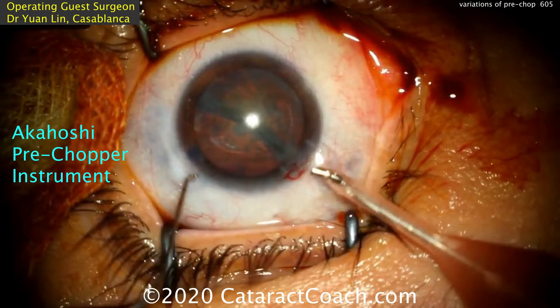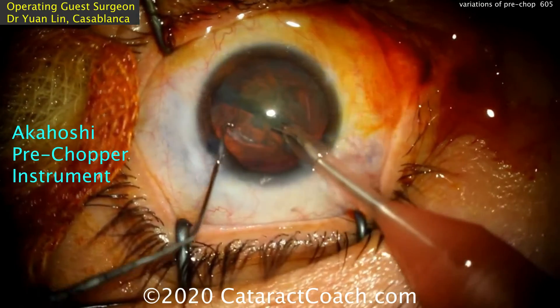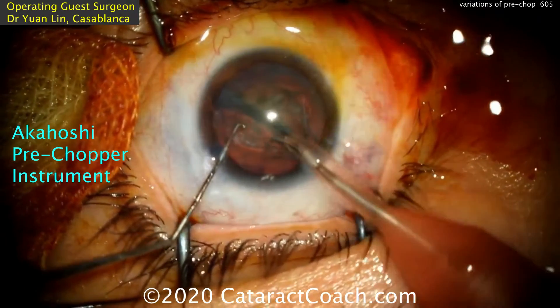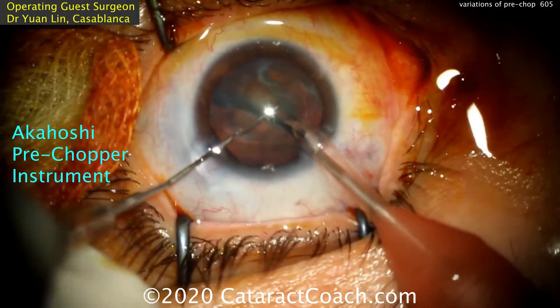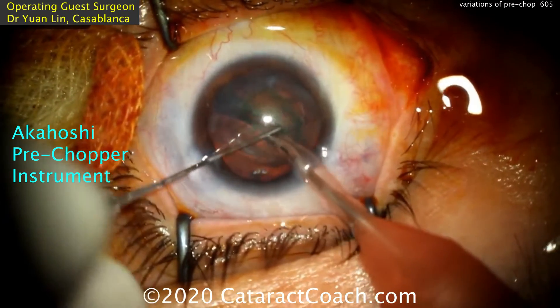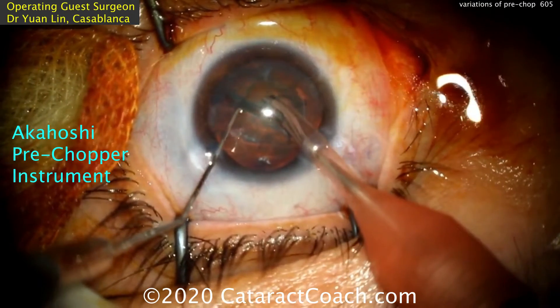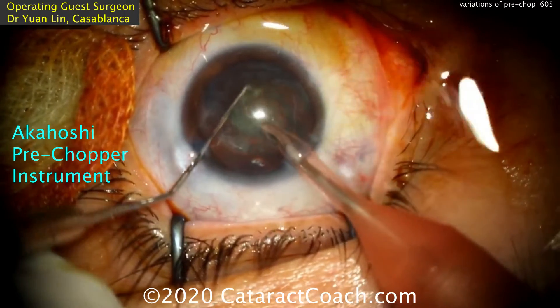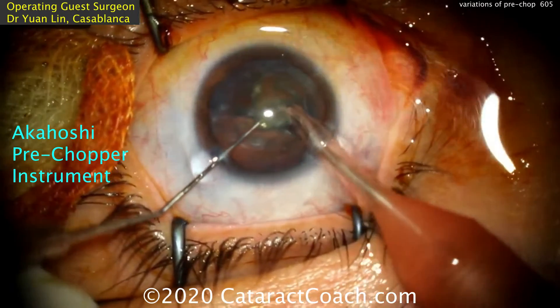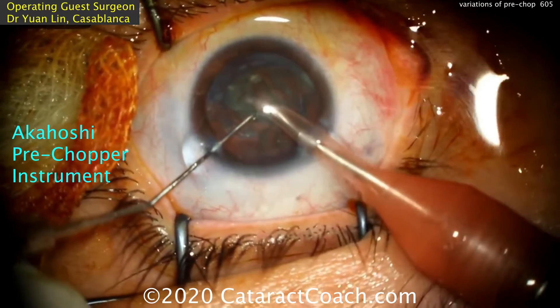Now with the nucleus split, we can put the probe inside the eye. There's the chopper. This device makes it easy to have two nuclear halves created instantly — you could even do quarters. Now the nucleus can be rotated, and there are the two separated heminuclear pieces. One can be aspirated here, brought up to the iris plane with high vacuum, and then this chopper will just chop it into bits. Works beautifully. That's the Akahoshi pre-chopper.